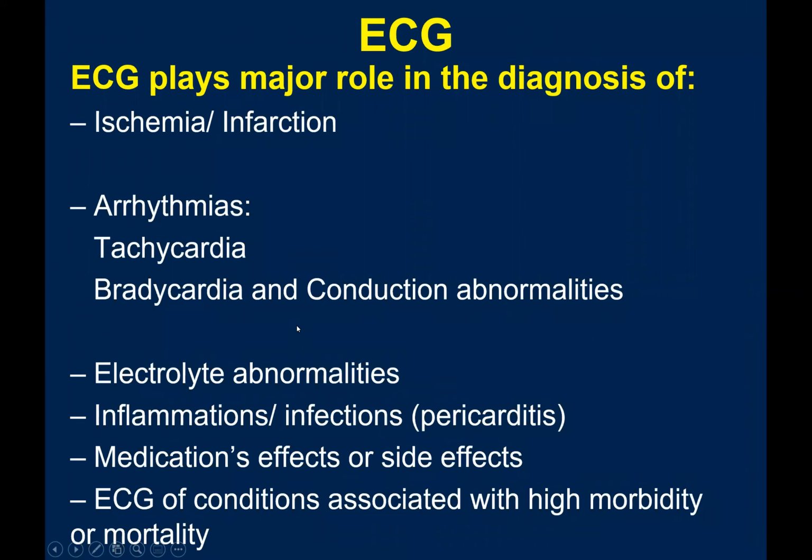Electrolyte abnormalities like hyperkalemia, hypokalemia, hypercalcemia, hypocalcemia, especially when life-threatening, it's important to recognize. Pericarditis is an important differential diagnosis of myocardial infarction, so ECG of pericarditis is also important in that regard. Medication effects and side effects: for example, if you're starting a patient on sotalol, then we follow the QTc. For side effects, for example, if the patient has a long QT interval or is having arrhythmias because of that, ECG is important. And some conditions might be rare but are associated with high morbidity and mortality, so it's important to recognize the ECG pattern.